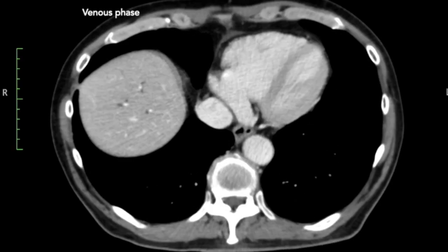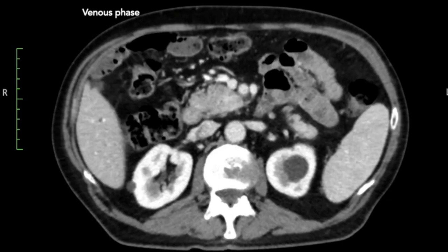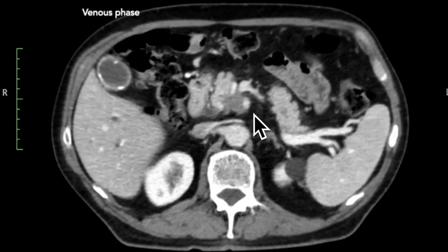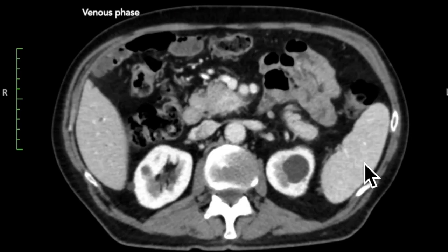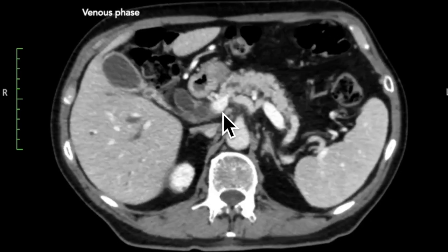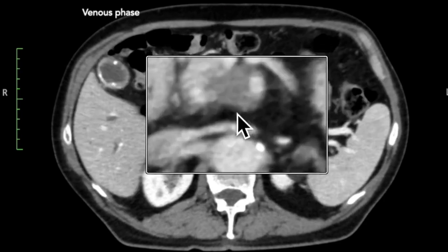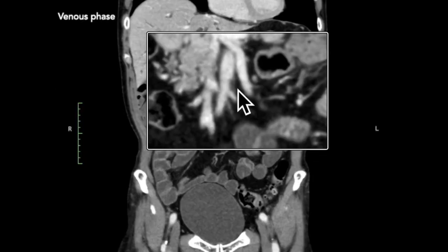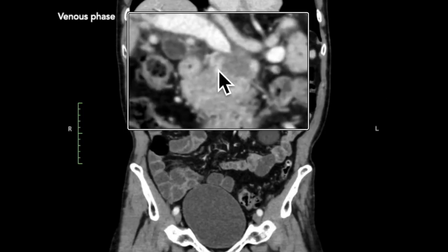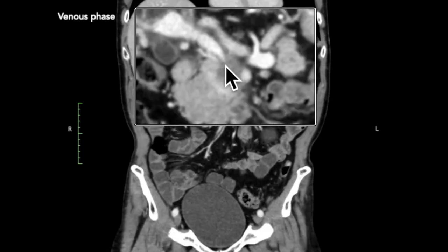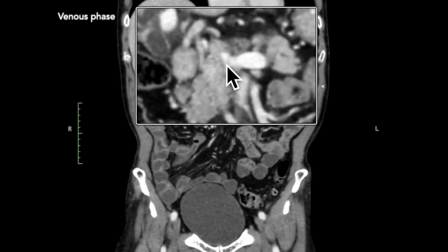The next step is assessing portal venous involvement, using the portal venous phase. Starting below the tumor and following the SMV upwards, there is tumor contact with both the SMV and the portal vein, with clear deformity of both. The amount of contact is 90 to 180 degrees, and there is more than 50% stenosis. This is also nicely appreciated on the coronal reformat — the tumor here causes deformity of the main portal vein, with more than 50% stenosis, almost occlusion of the portal vein and superior mesenteric vein.